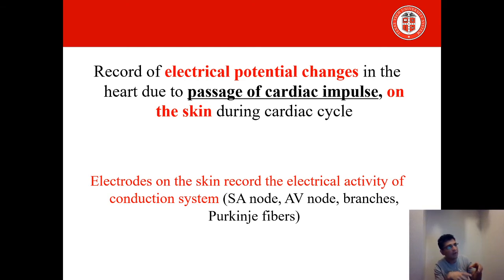And this is what I have tried to highlight using two different definitions, the one at the top and one in the second half of the slide. Again, I'm repeating, the electrical activity of the heart, which is recorded on the surface of the skin, is known as ECG. I want everybody to be extremely sure what we are recording once we do it in our lab.